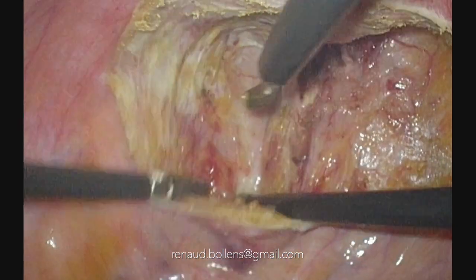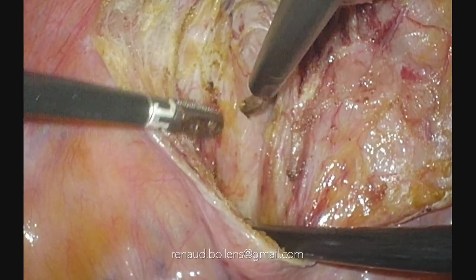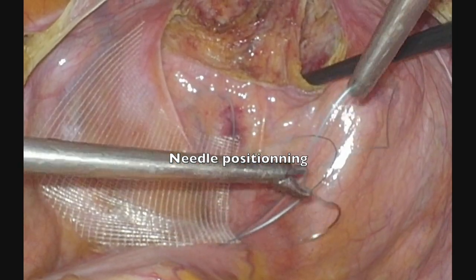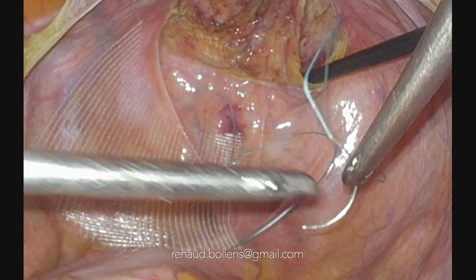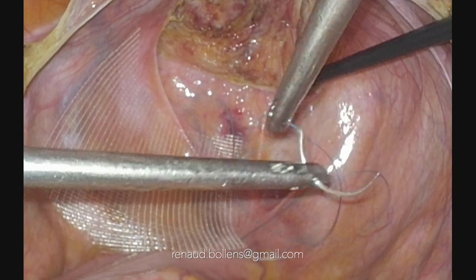Okay? Then when you do blunt dissection, the more you have direction of traction, the more efficient the movement will be. Well, basic techniques concerning the needle position. In fact, we have four parameters that define the position of the needle. You have, of course, the right hand, or you can put the needle in the left hand.